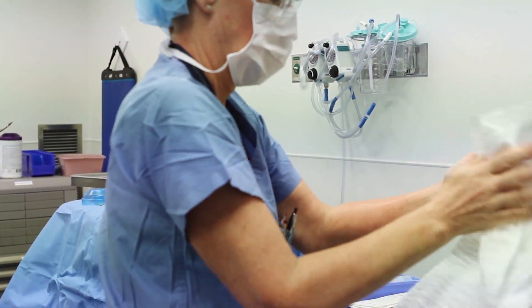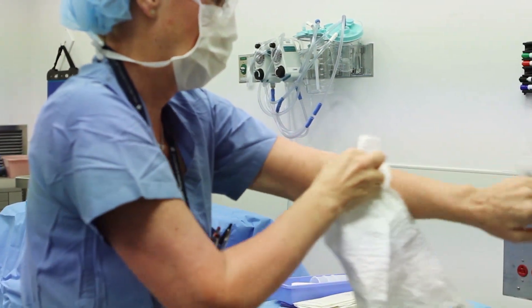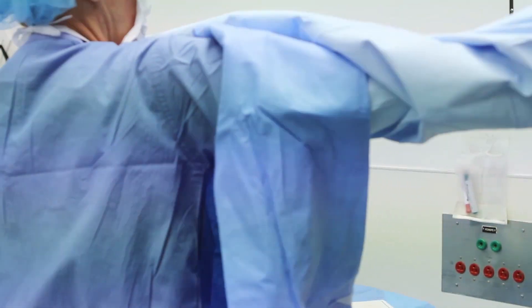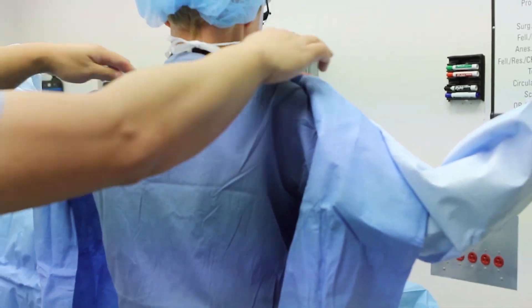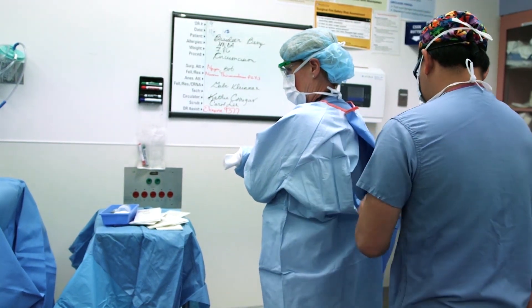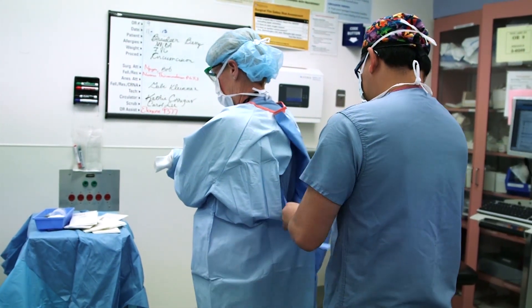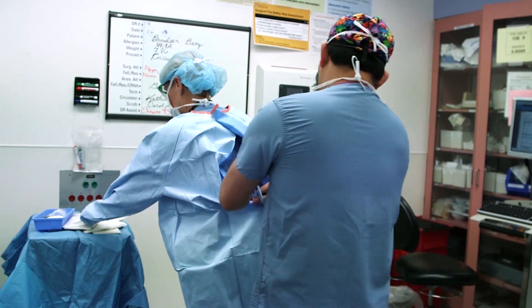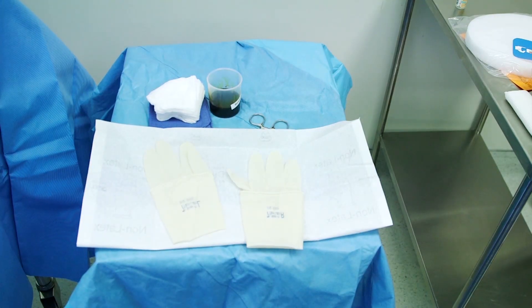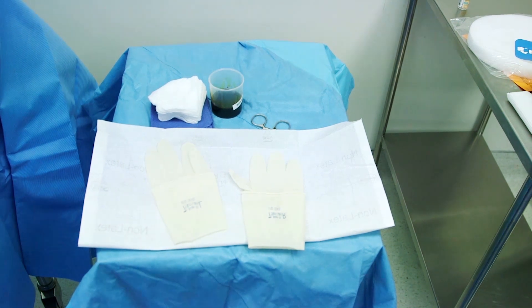It should be done carefully to avoid accidental contamination of the sterile field and supplies. Next, the gown is removed from the sterile field and put on. A non-sterile member of the team can secure the gown in place by tying the ties on the back of the gown. Finally, gloving is performed. When putting the glove on sterilely, it can be performed with the help of a member from the surgical team who is already gowned and gloved, or can be done by oneself.